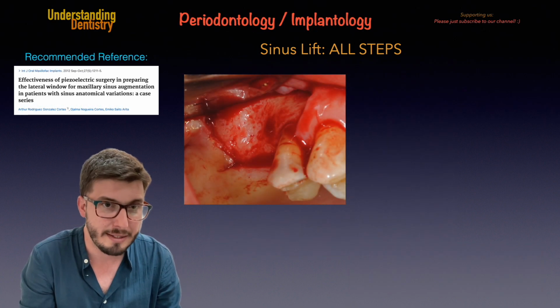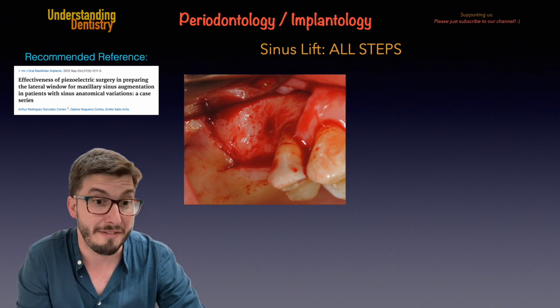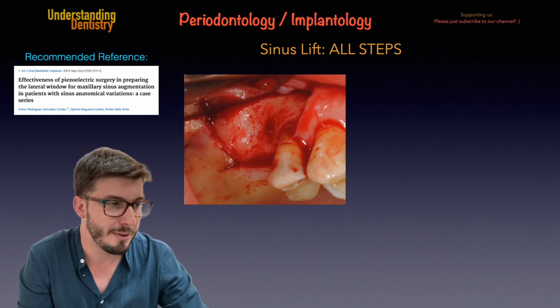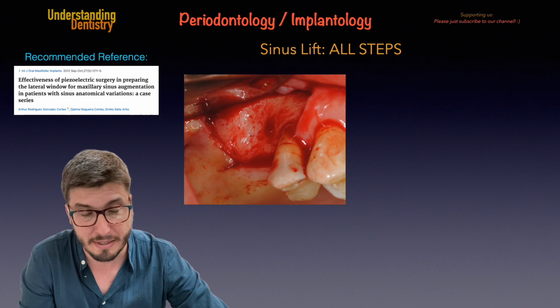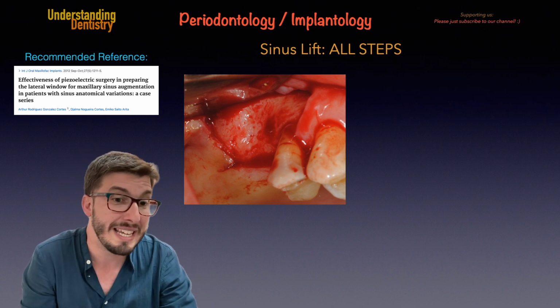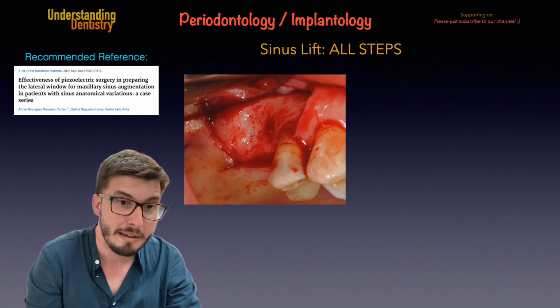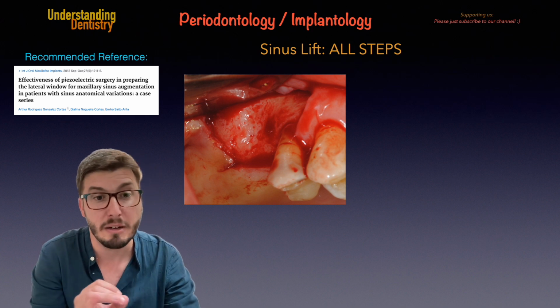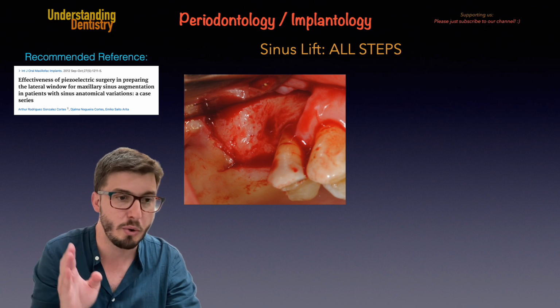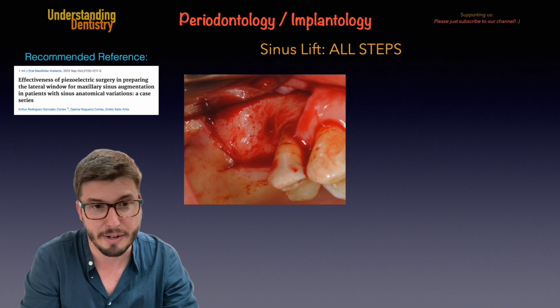After the planning, the first step, now I'm talking about the surgery, would be to open a flap. And there are many flaps acceptable to do that. You can go back to my video of periodontal flaps if you need. This is just a trapezoidal flap, with two releasing incisions. The mesial releasing incision starts on the mesial aspect of the buccal surface of the second premolar, always going divergent, because then we have a larger area.